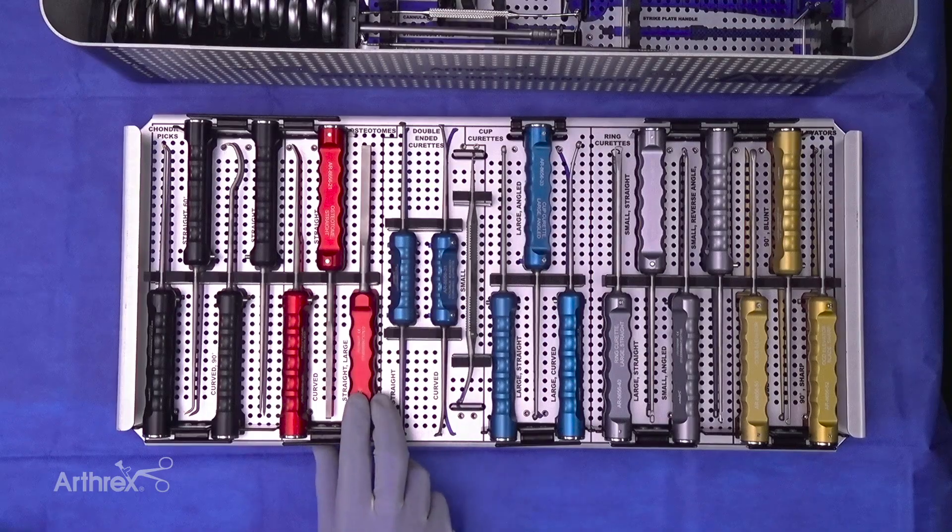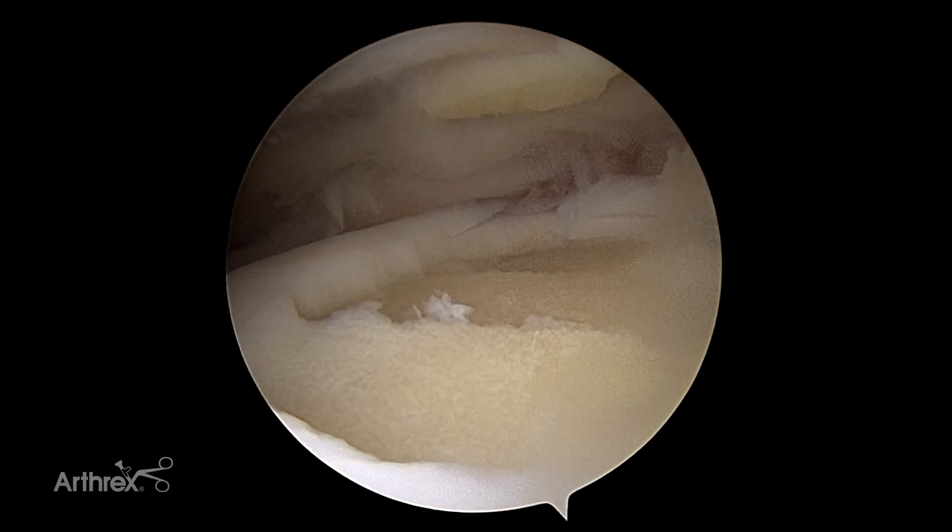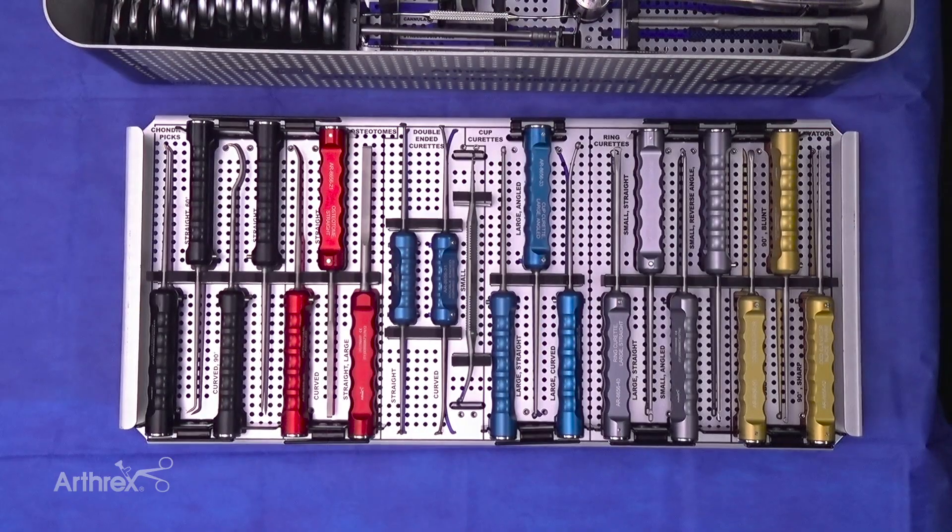The larger osteotome will make quick work of the talus and the distal tibia when a surgeon is performing an arthroscopic ankle fusion.